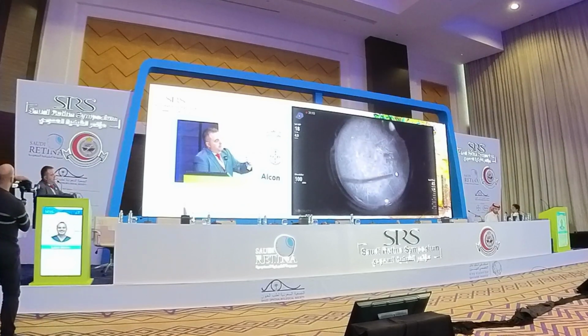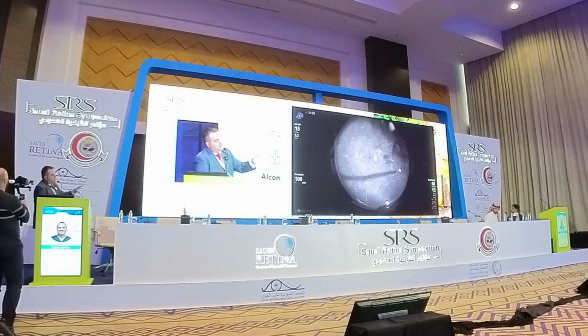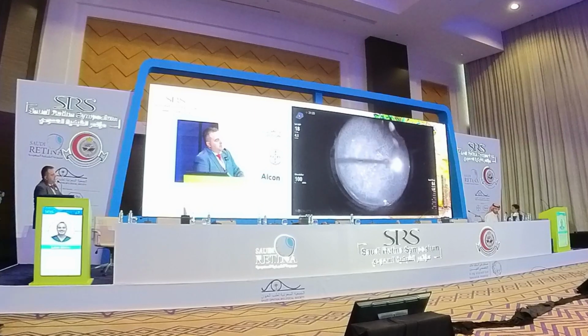Here I need to say that the effect of fluorescein fades out, so we need to be a bit more in a hurry in order to see the zones of non-perfusion and to laser them. Why is that important, in my opinion? Because normally, at that stage, we might assume that we will do a total PRP, but when you laser a perfused retina, not a healthy one, but still perfused, I believe we induce a different type of inflammatory response compared to the already non-perfused areas, which is directly related to the postoperative result.